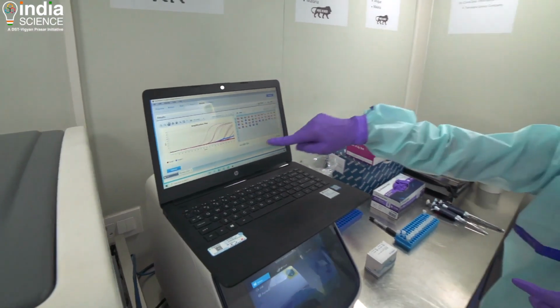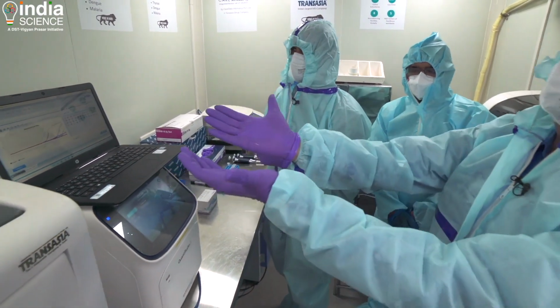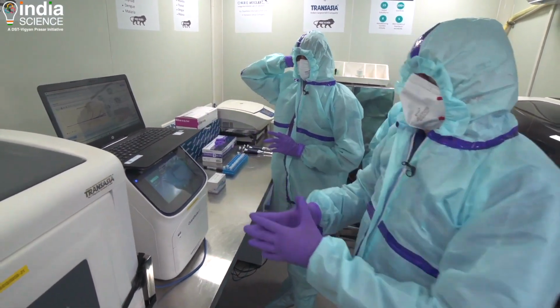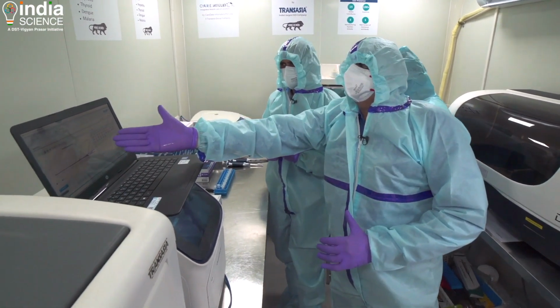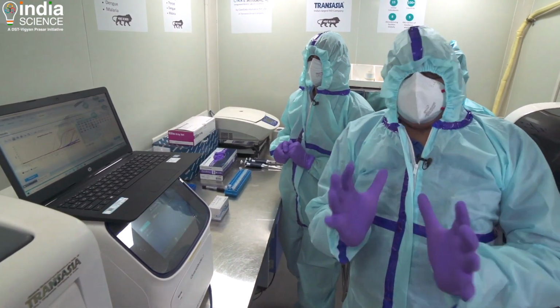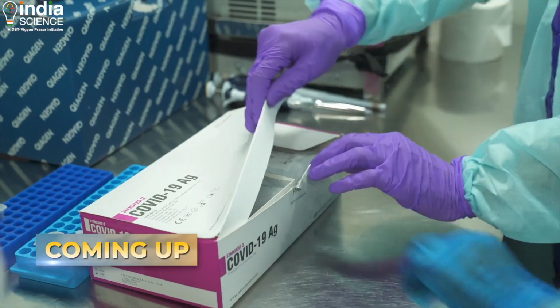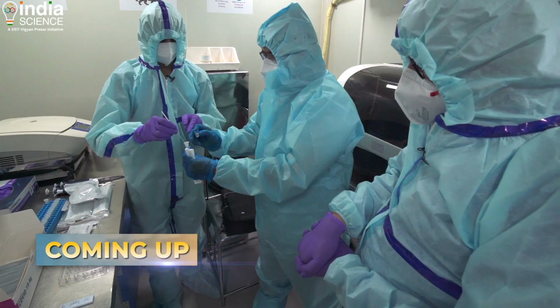This is where you get the CT values, the CT values that everybody talks about. This also shows clearly whether a person is carrying the infection at that moment or not. So this was the RT-PCR machine, and it shows how many people in this particular run tested positive. This is one way of testing COVID-19, which is the RT-PCR. Then there is the antigen test, which is much shorter, and as it says, it is rapid. It takes about 15-20 minutes.